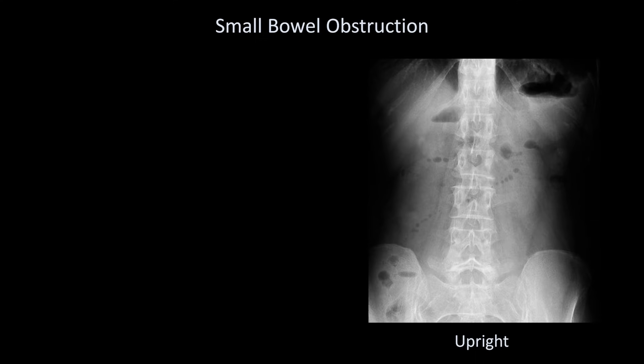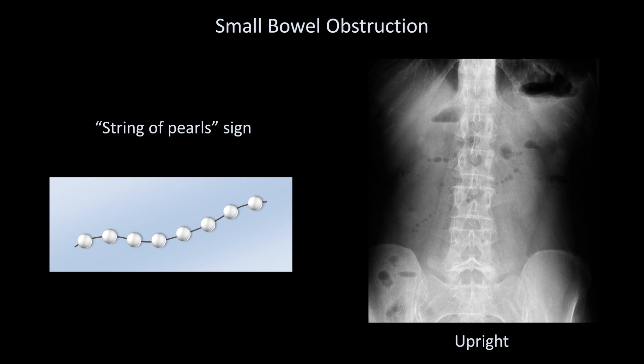This other upright film may not be as immediately obvious an example of an SBO, but it is a good example of the string of pearls sign, in which a chain of small air bubbles are caught between mucosal folds within an otherwise fluid-filled bowel loop. Each one looks round instead of having miniature versions of classic air-fluid levels due to the effect of water's surface tension at that smaller scale.